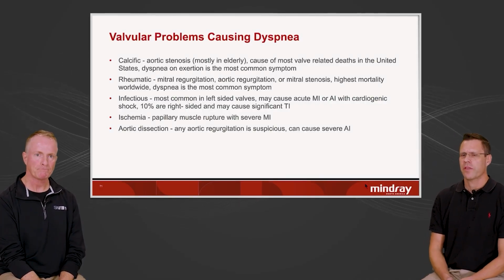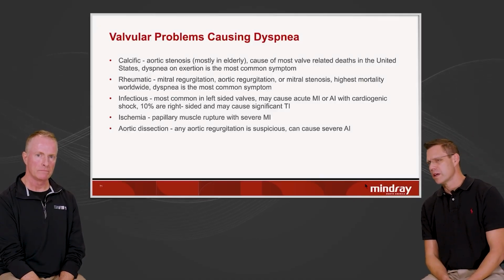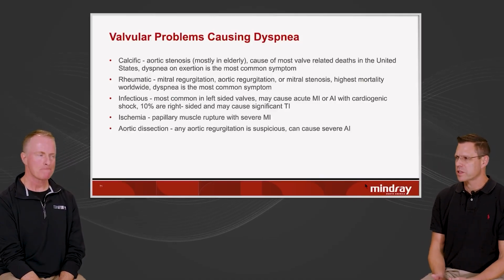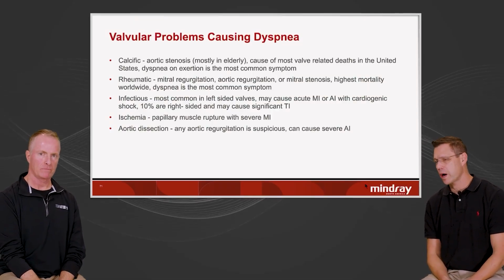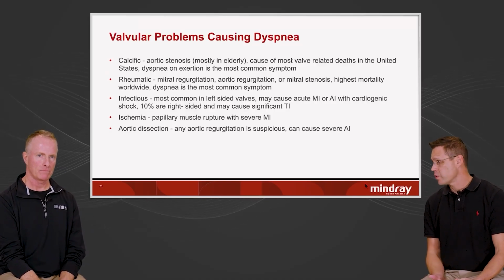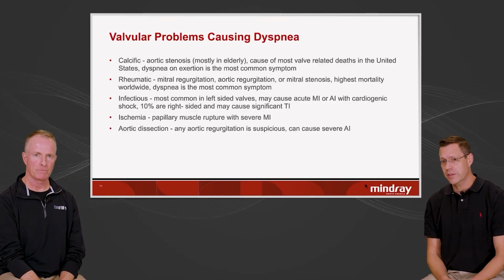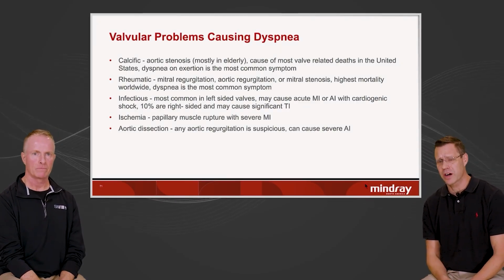Yeah. I think one of the fallacies that people have when they think about valve problems is that they're thinking about murmurs. Yeah. And at our small facility where we can get an echo once a week, that person could go a long time with a very significant valvular problem that goes undiagnosed. And sometimes severe AS has no murmur when it's so advanced, if they haven't presented previously, but it's an extremely easy diagnosis when you actually look at the heart.